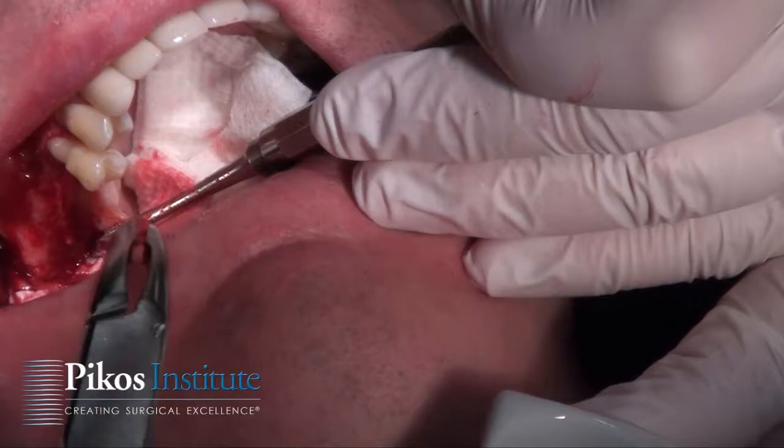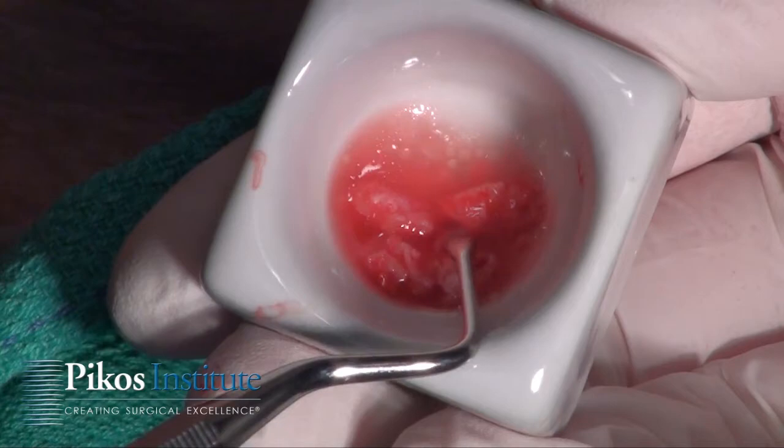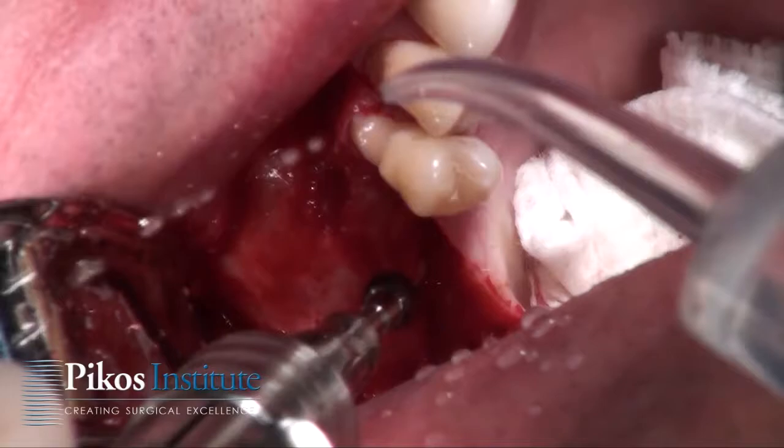Another reason to extend to the distal aspect of the tuberosity with that incision design is that I may want to harvest some of that bone. We're saving any autogenous bone harvested from the tuberosity using the rongeur, and then flattening the ridge in preparation for the implant osteotomies.